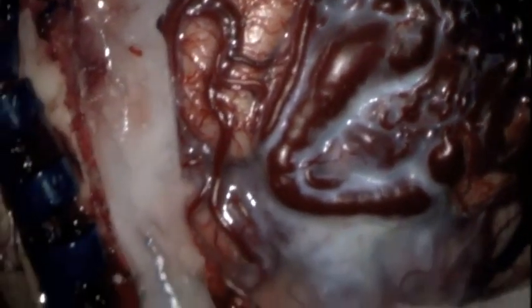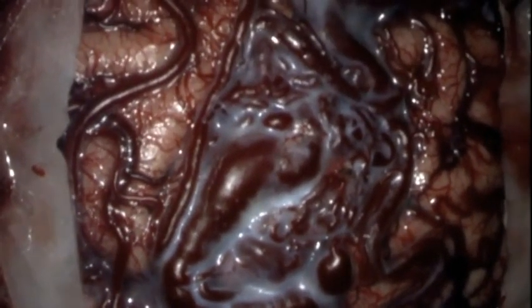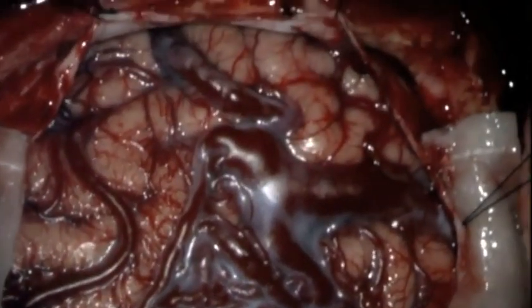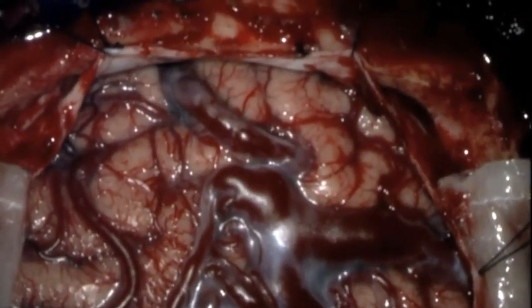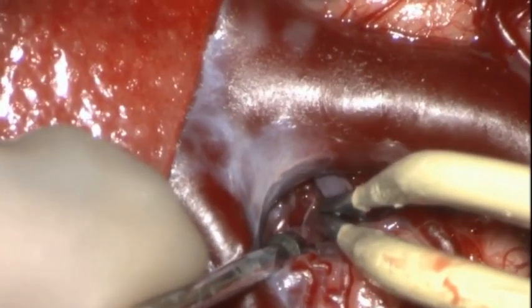Once adequate exposure is achieved, subarachnoid dissection can begin. The dissection may begin at the parietal occipital sulcus. This helps free tethered veins from the arachnoid and expose the AVM margins circumferentially. Opening the arachnoid also permits CSF release and relaxation.